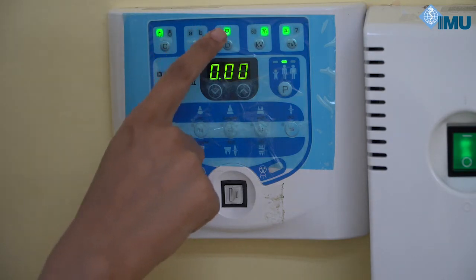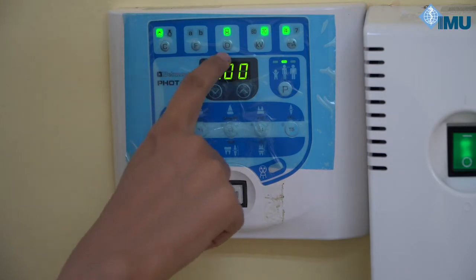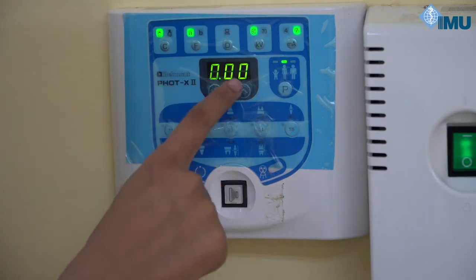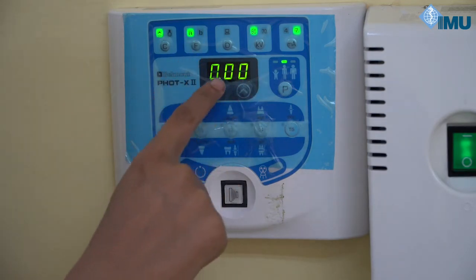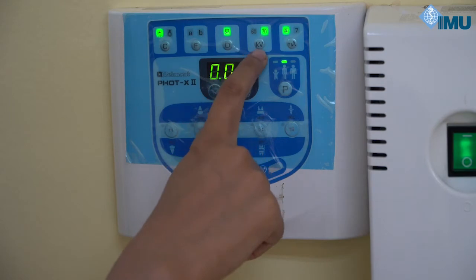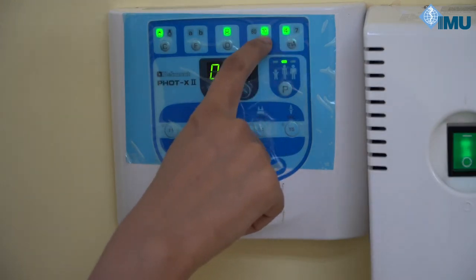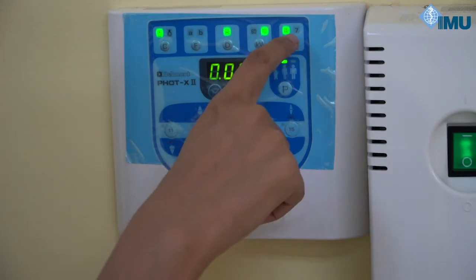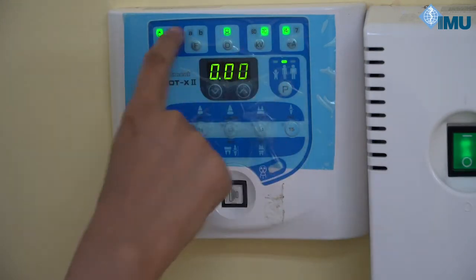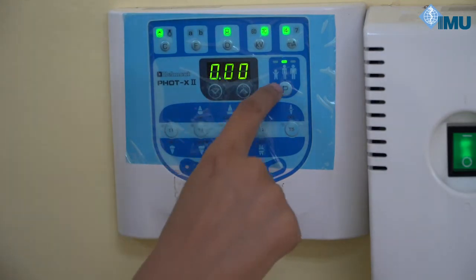We are using digital here, so no need to select film. Make sure you select digital — if you select film, your exposure parameters will change. The format must be digital. Tube voltage and tube current are also auto-fixed to 70 kV and 4 milliamperes. These are the parameters to set before selecting the teeth.